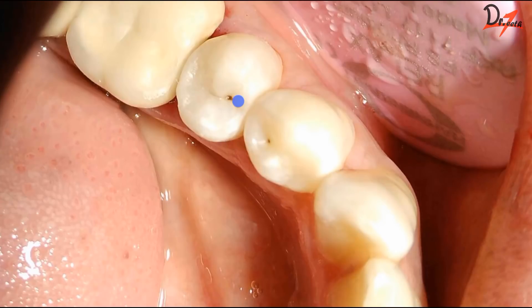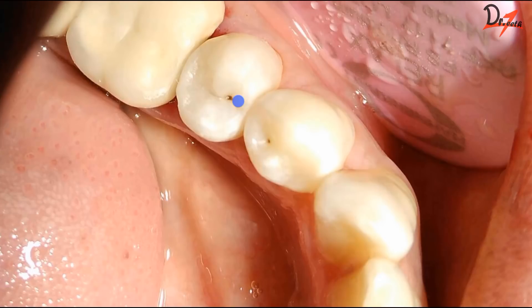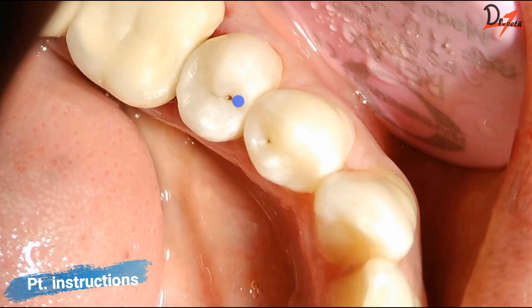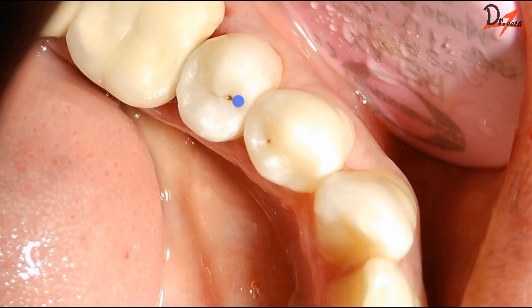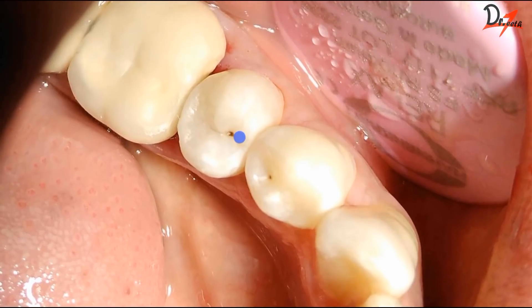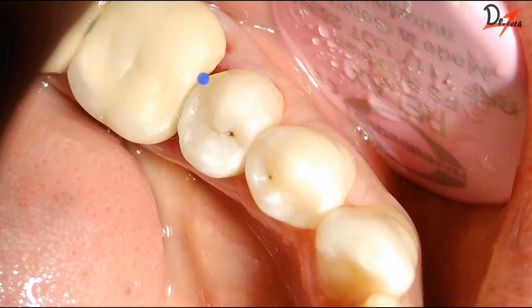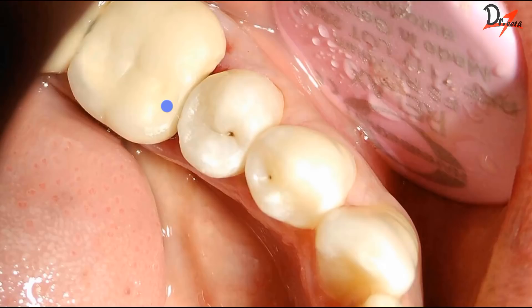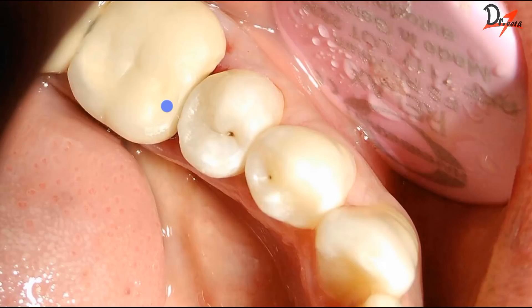We have to check for any high points by asking the patient to bite. Excess flash — the excess material — is cleaned using a yellow-ring grit diamond point, which is a tapered-shape bur, or a Sof-Lex disc can also be used. The patient was instructed to be cautious while biting extra hard food, and also advised to floss in that area since the adjacent crown's overhang could again lead to food lodgement.